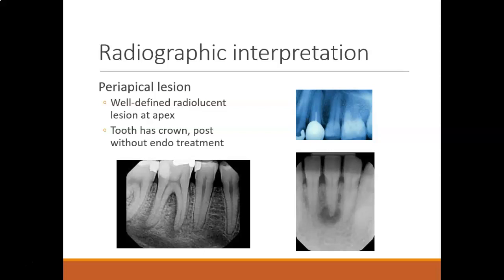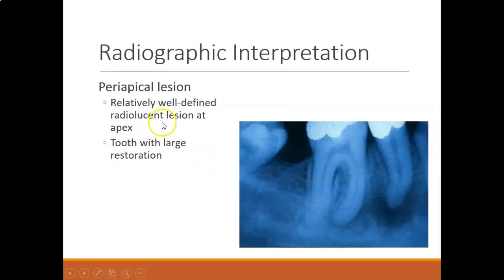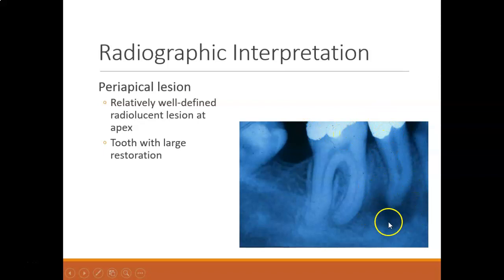Periapical lesions appear as a well-defined radiolucent lesion at the apex. Here are a couple good pictures with really well-defined radiolucencies at the apex. This tooth has a crown and a post but no endodontic treatment, and you can see radiolucency at the apex of this anterior tooth. These are other examples of well-defined radiolucent lesions at the apex — some with really large restorations, some pretty well-defined, and others showing just widening and not as well-defined.